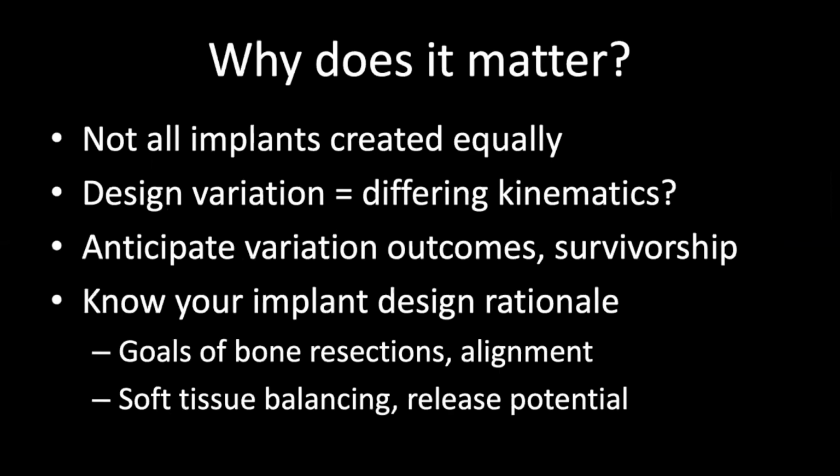So why does all this matter? There are several different designs with these different manufacturers, and not all implants are created equally. There is design variation, which may potentially lead to differing kinematics, and we would anticipate a variation in outcomes and survivorship based on these differences in designs.